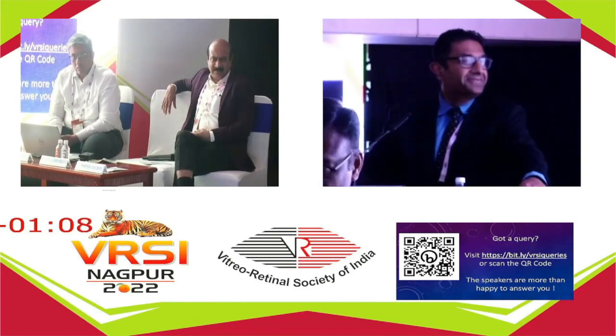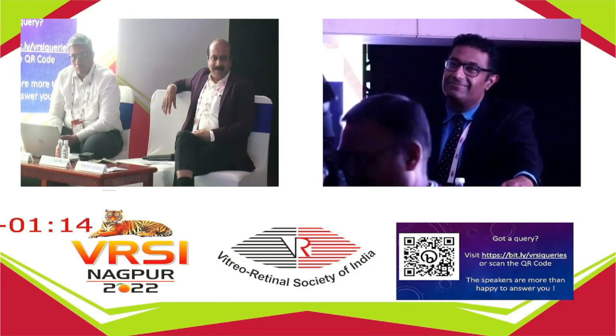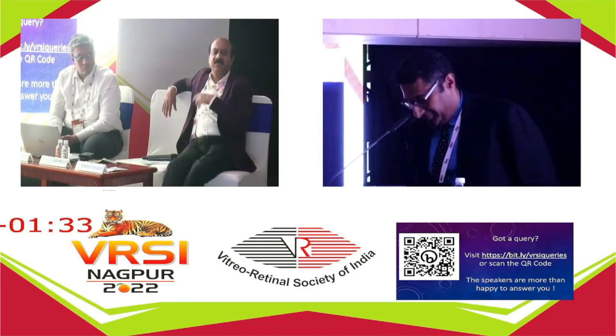I just want to counter one point about resolution, because all the other technologies actually use an LED flash, while here in the ultra-wide field modality they are using lasers. So this has better resolution with better penetration, whereas all the other cameras use only LED flashes. LED flash can't penetrate below the retina.